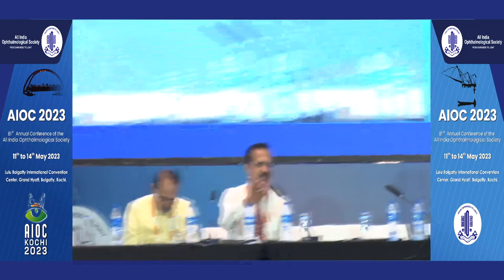You can get the posterior aspect also with the Barrett online toric calculator, so you can just use that. In fact, that's all I use.